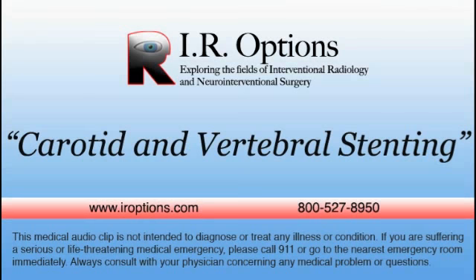Successful stenting is followed by rapid discharge to home and treatment with the blood thinners Plavix and aspirin. A neck ultrasound exam is performed 6 and 12 months later to assess for any vessel renarrowing. At present, Medicare will cover the costs of carotid stenting in patients where the carotid narrowing is 70% or greater and is symptomatic, and if a patient is at high risk for carotid endarterectomy.